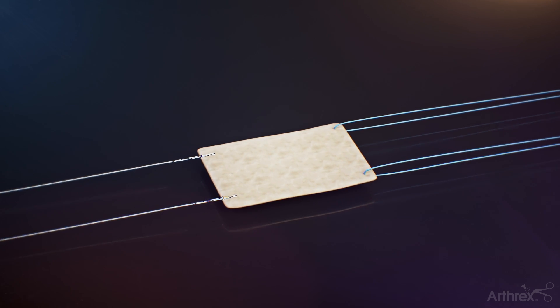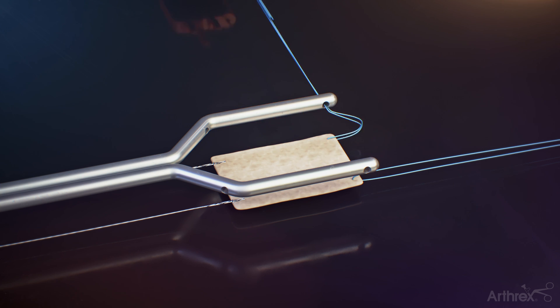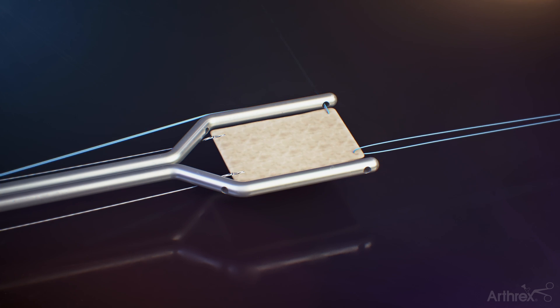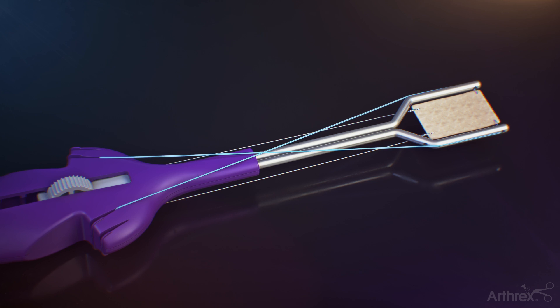Load the ArthroFlex graft construct onto the graft spreader by first loading the tails of the medial zero fiber wire suture through each corresponding arm of the graft spreader. Dock the medial number zero fiber wire sutures into the inner cleats located on the handle of the graft spreader in a crisscross pattern.